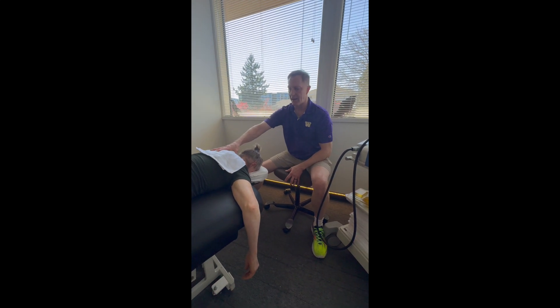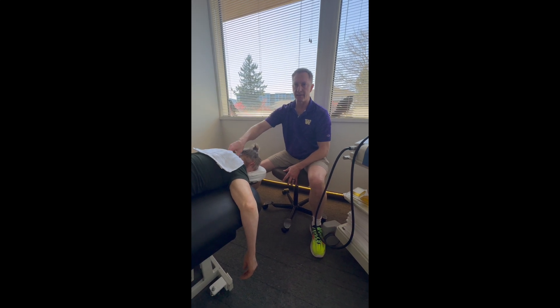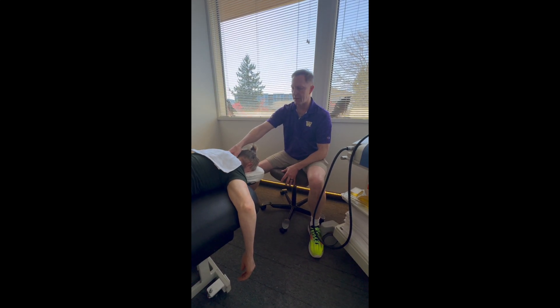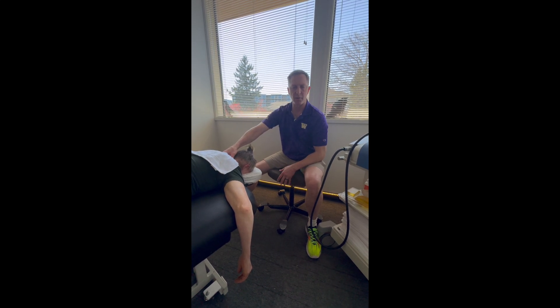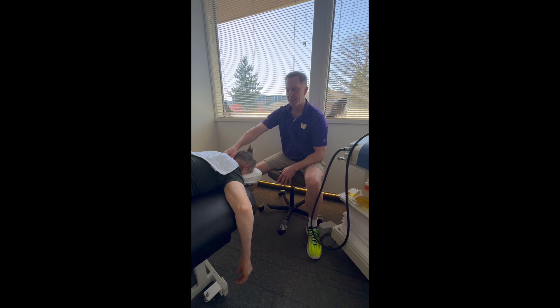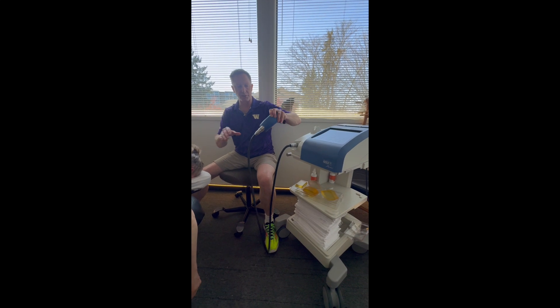We have a patient here who has a neck problem and a very rigid lower neck. The entheses — the bone-tendon interface and bone-ligament interface — where these muscles, tendons, and ligaments go into the bone, it becomes very rigid and very hard. So what we're going to do is use our glorified massage gun.